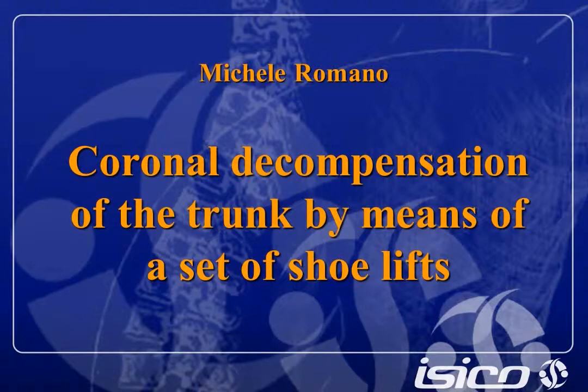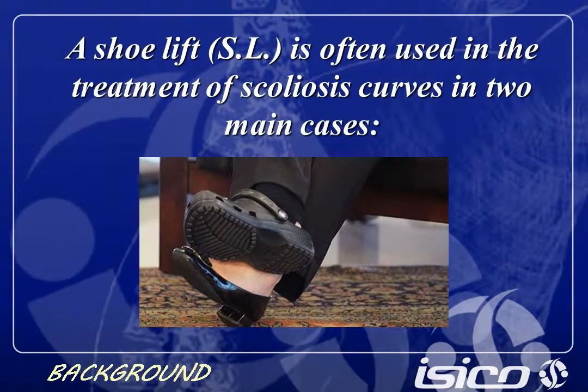The topic of this presentation is the use of shoe lifts in the treatment of patients with scoliosis. Why do we use a shoe lift in the treatment of scoliosis patients? Normally, we use the shoe lift in two main cases.